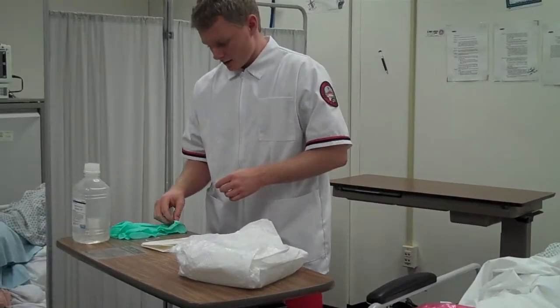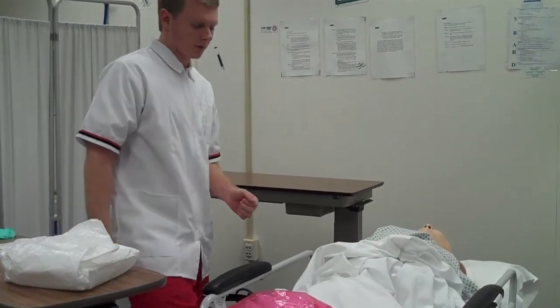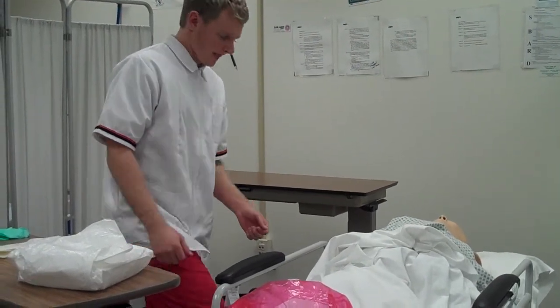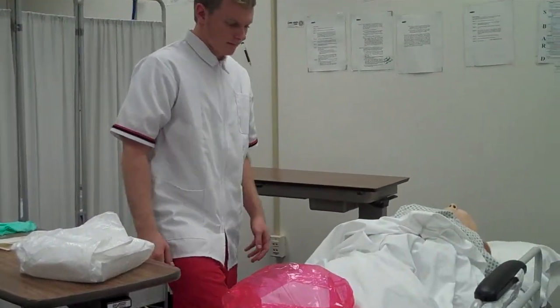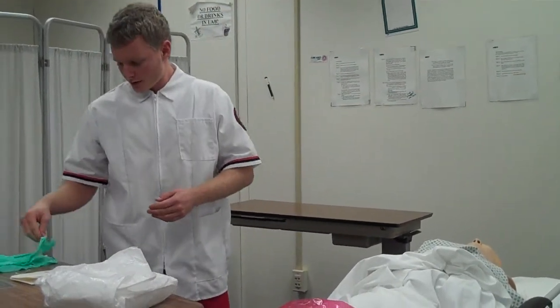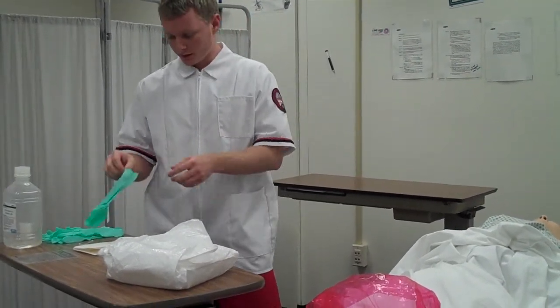Alright, now I'm going to raise the bed to working height. I'm going to lower the side rail. Alright, and what I'm going to do now is apply my clean gloves. After I wash my hands, I'll apply my clean gloves.